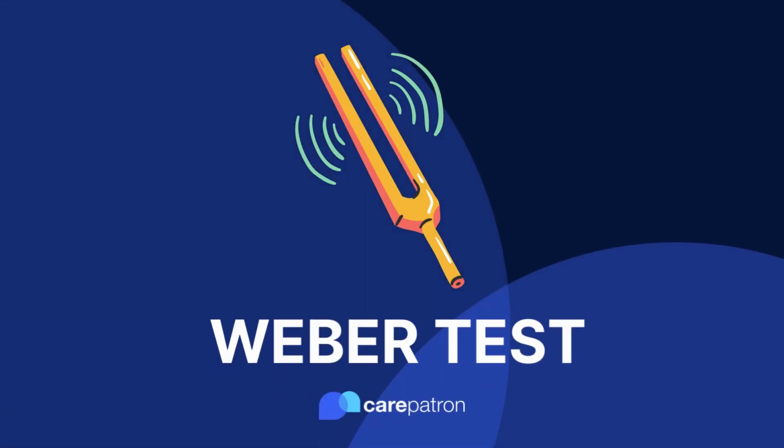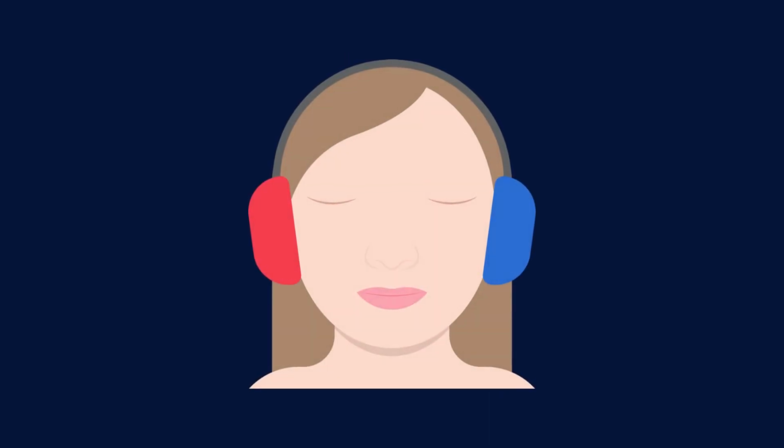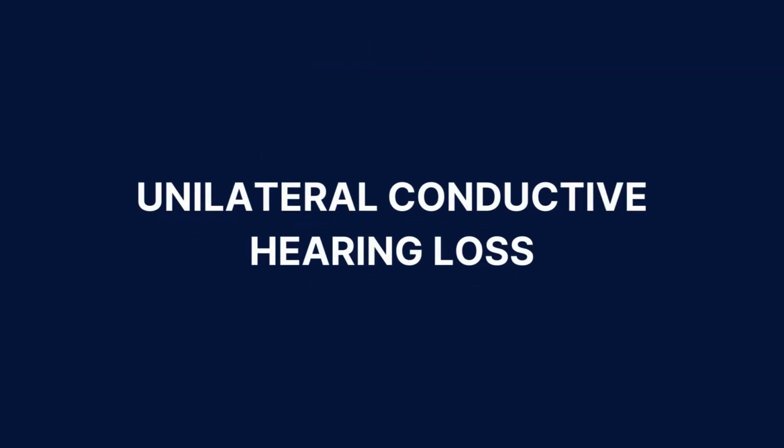The Weber test is an audiological clinical assessment. The test is designed to gauge a patient's hearing loss using a tuning fork to see if the hearing loss is unilateral conductive or sensorineural. Unilateral conductive hearing loss is a type of hearing loss where the sound coming from the tuning fork lateralizes to the affected ear, which means that the sound is louder in the affected ear.